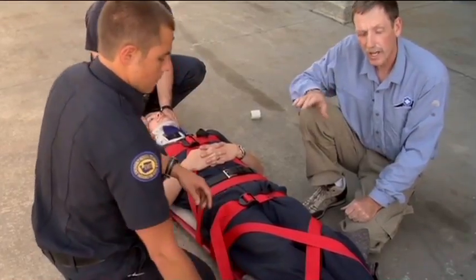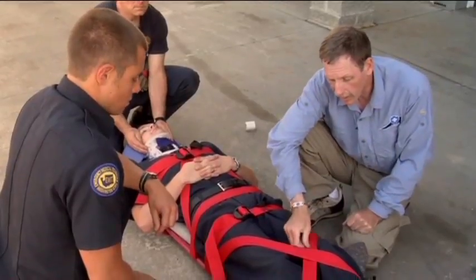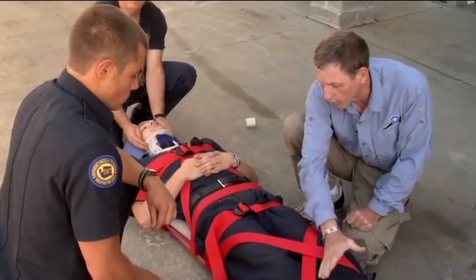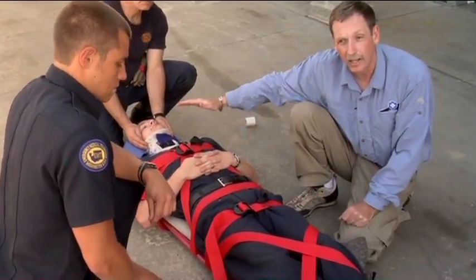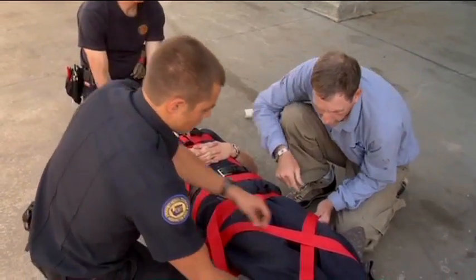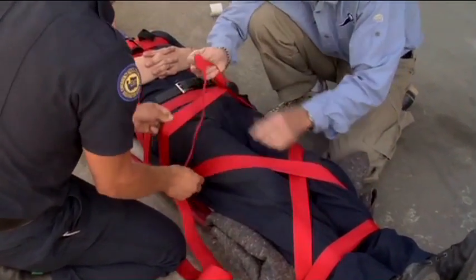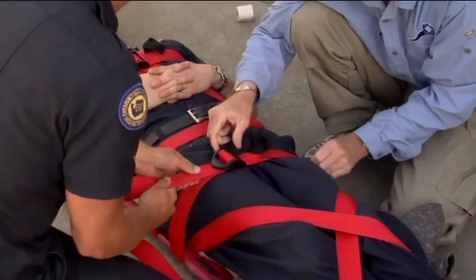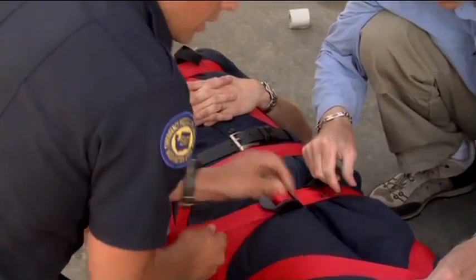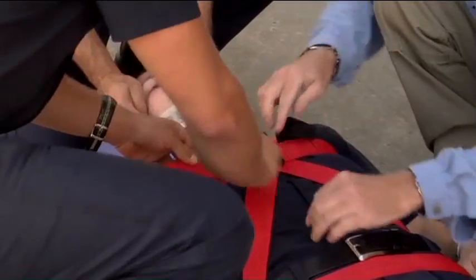All right, the straps are now affixed. What we need to do now is milk out any slack in the straps, and we're going to go from foot to head, and that will remind us that the head is always affixed last. So if we can start sliding down, go ahead and give it a little tug. How's that feel? It's pretty good, nice and tight. Okay, we're going to do the next one here.